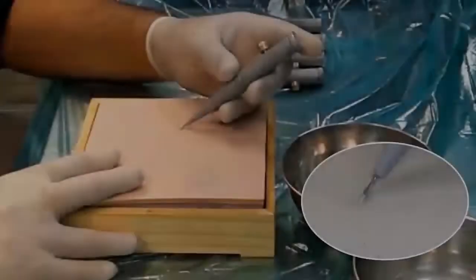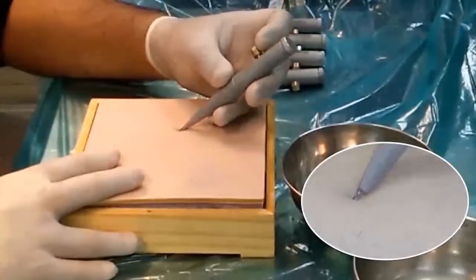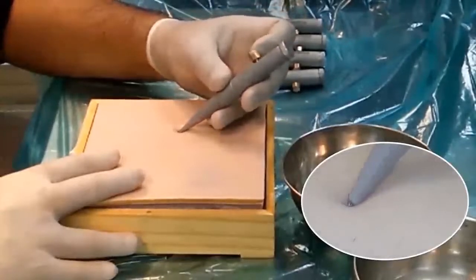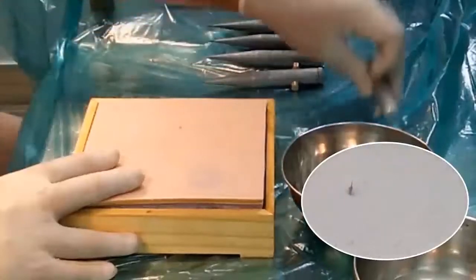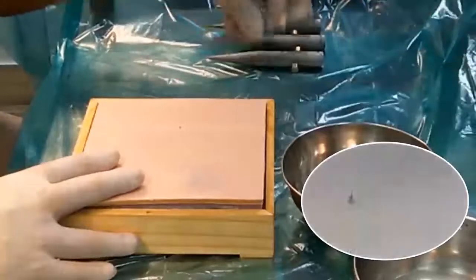The graft implantation process. Simply insert the entire length of the needle into the skin, with the upper end of the graft still lying above the skin. Now simply release the lock of the plunger and slowly withdraw the pen. That's it — the graft will be securely placed in the skin. With this pen, anyone with no experience in hair transplant can also do the implantation with absolute ease.